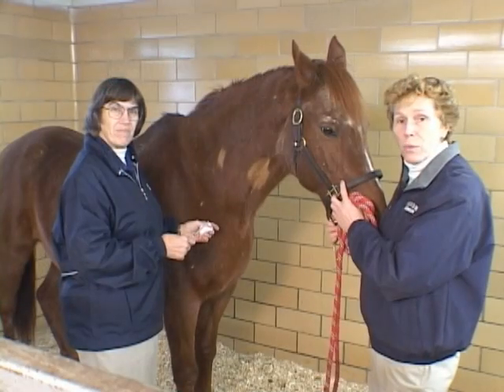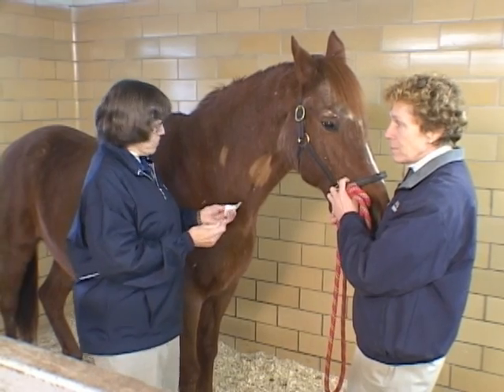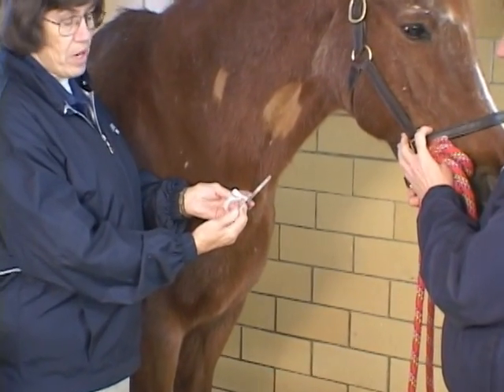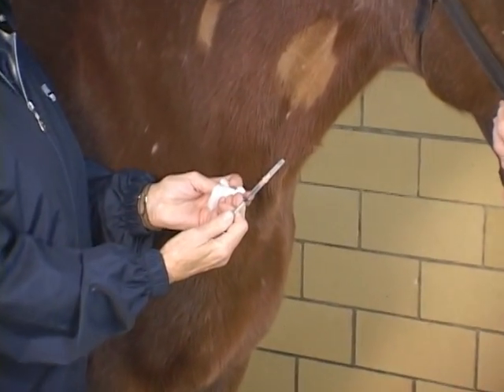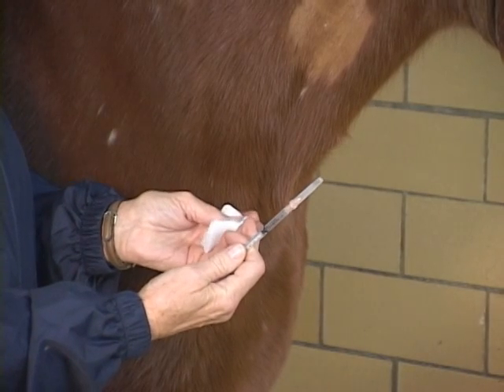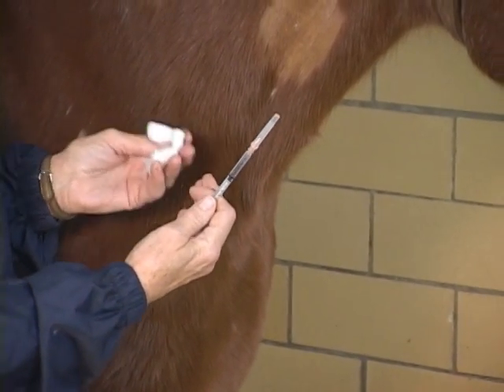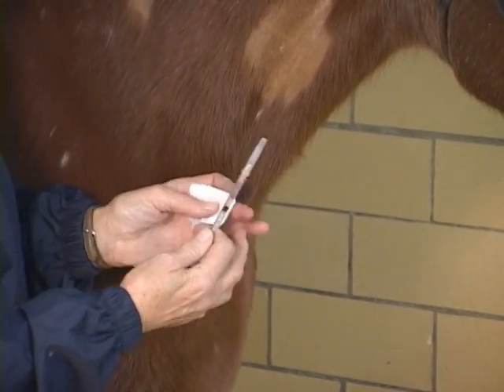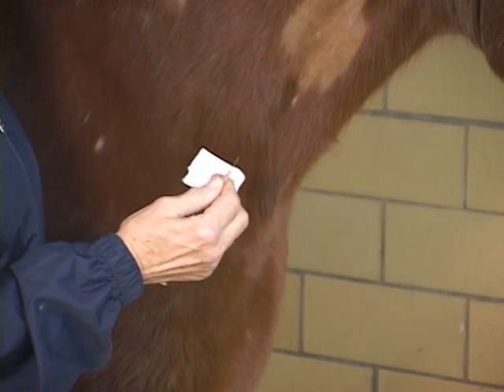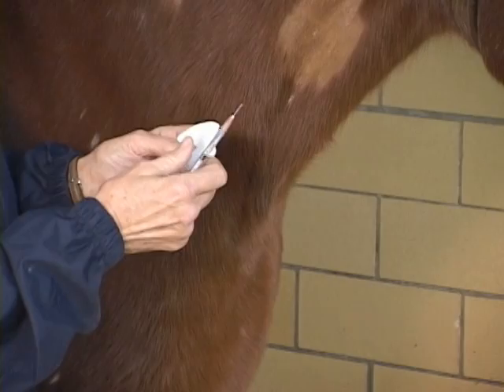The last of the injection techniques we're going to show is intradermal injection. You can see what I have here is a very small syringe, usually because you're just doing very small amounts intradermally. You'll be doing a half cc, one cc, usually not more — it's very hard to get more than one cc into a bleb intradermally. I also have a very small needle. You want a 25 or 26 gauge needle because we're actually putting this into the layers of the skin.